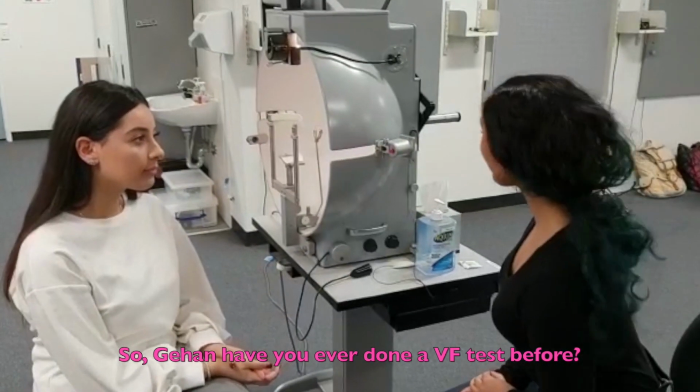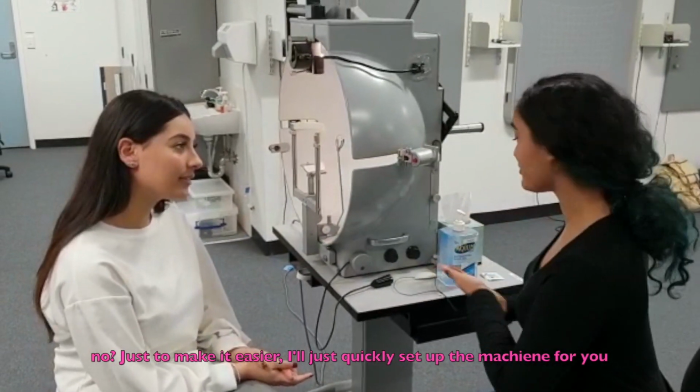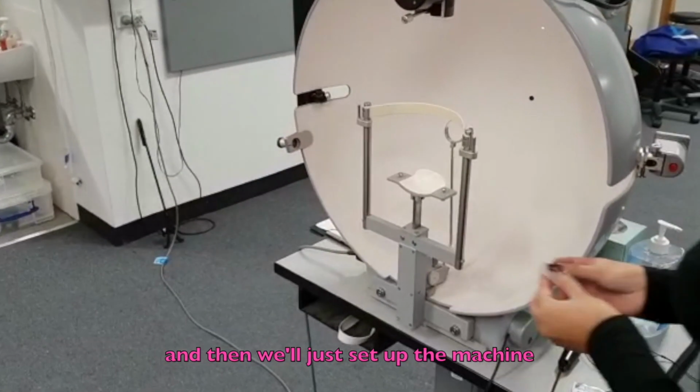So Jihan, have you ever done a visual field test before? They're really quick and easy. I'll just quickly set up the machine for you. So I'll clean up the iPad first for you, and then we'll just set up the machine.